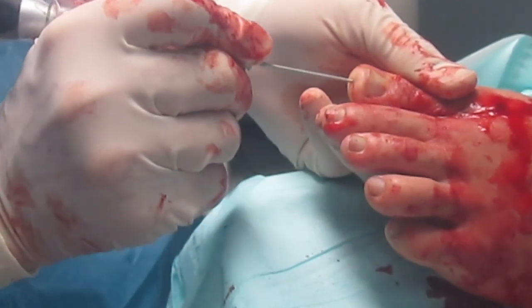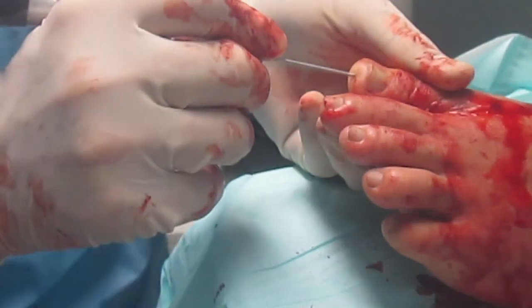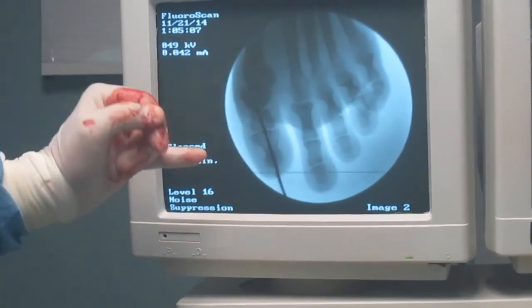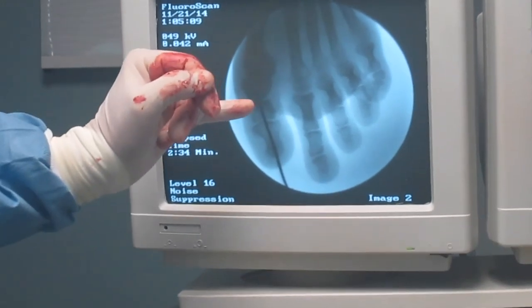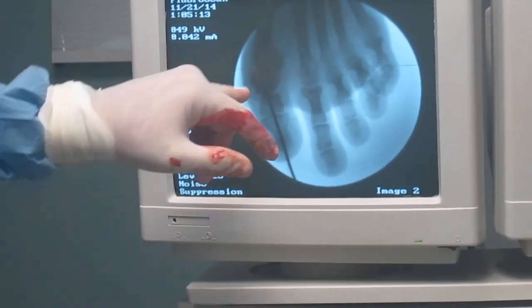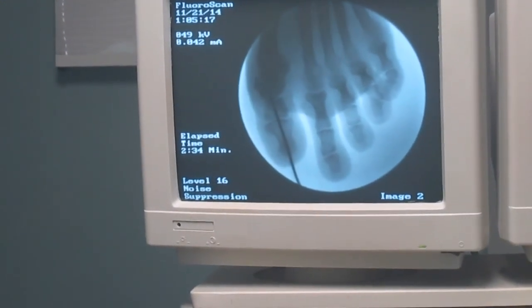Now at this point what I do is make sure I'm in the right spot under my C-arm here. What I basically did was take a wedge out of the hallux, transposition it over laterally, so that we have better pull with our flexor muscles. We've closed down the osteotomy on the first ray too. And now you can see her foot now, look at this. Look how much better her foot looks now, appearance-wise. Even loaded, that toe's gonna be in a much better position.